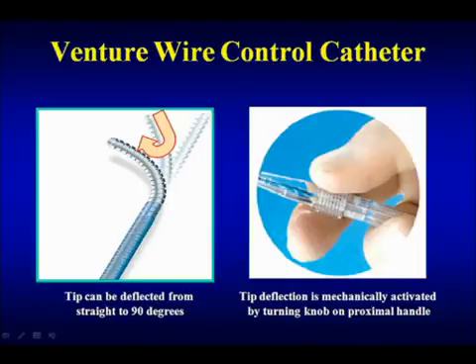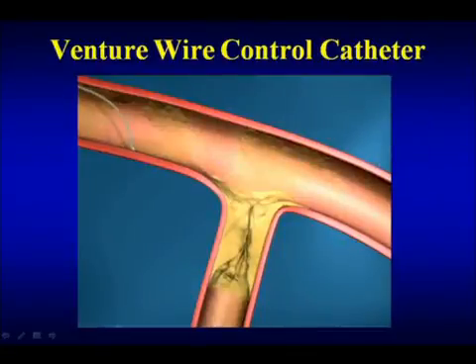Then the Venture is actually, if you remember, a lot of magnetic systems came into the cath lab for angulated lesions, with a lot of publications that it takes less time to go into the angulated lesion using Magnetic navigation and so on, and basically one device in my opinion which put the death nail on the magnetics in interventional cardiology is the Venture. That is that you can change the direction of the catheter tip to 90 degrees so that you can go to an angulated lesion, and this is a very nice demonstration.